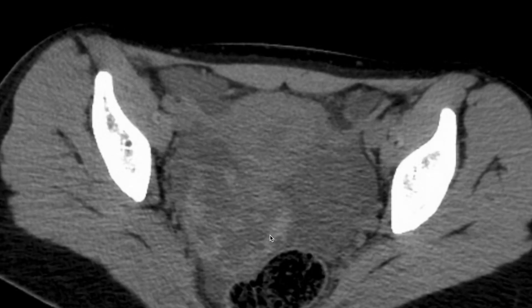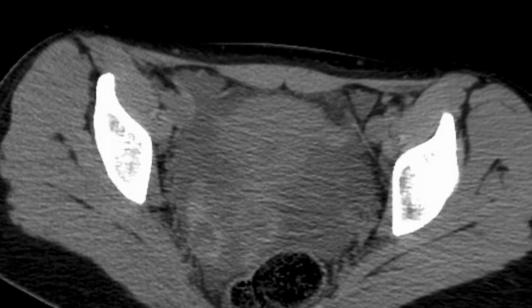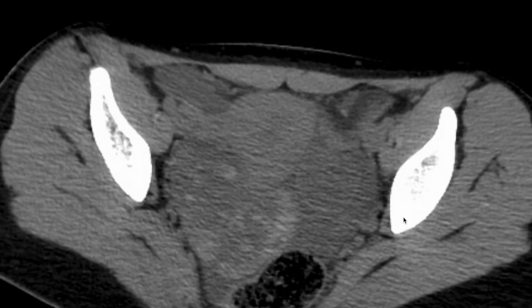Because the ovary is torsed, the pelvis is kind of inflamed — there's some free fluid in the pelvis, probably reactive to what's going on. This is an emergency. OB-GYN needs to be called, and they would need to go in and fix this before the ovary dies from lack of blood flow.